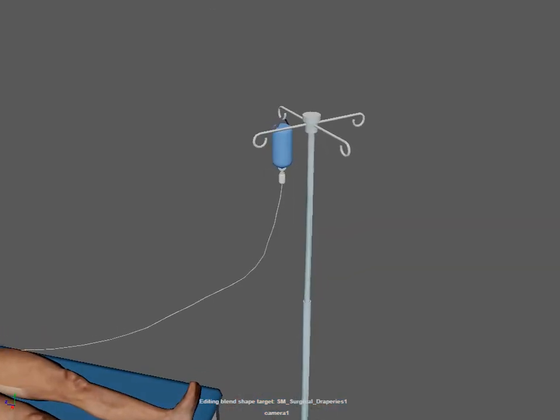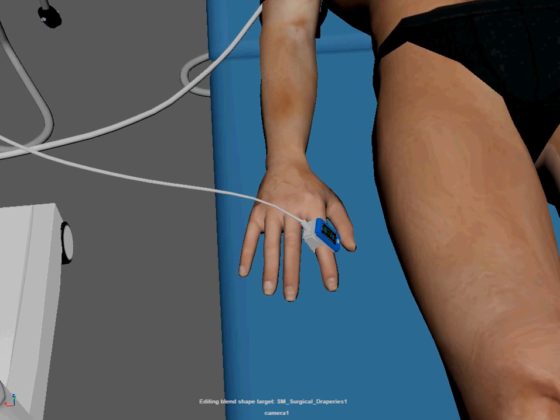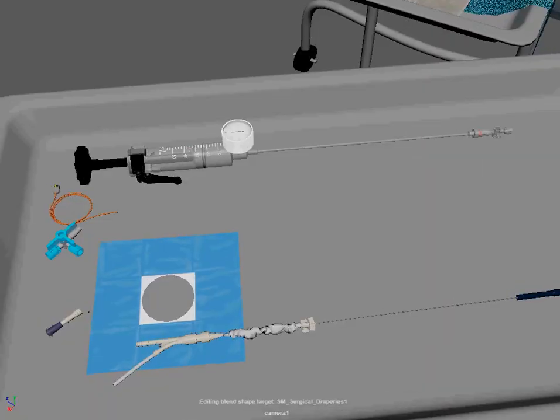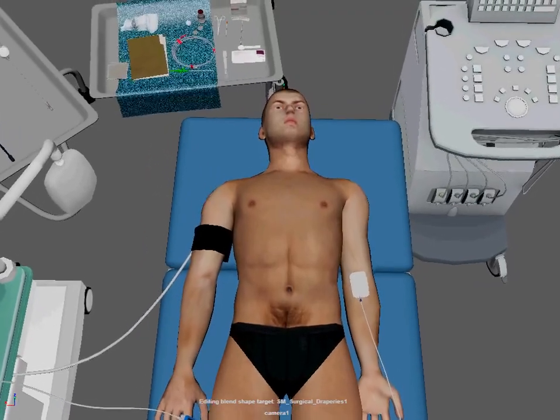Before starting the procedure, gather all the necessary equipment. This includes the IABP console, IABP catheter, sterile gloves, antiseptic solution, sterile drapes, syringes, heparin, and sterile dressings. Having everything ready beforehand will ensure a smooth and efficient process.